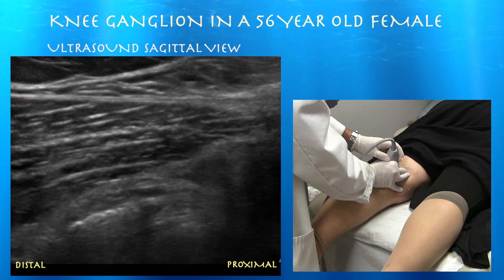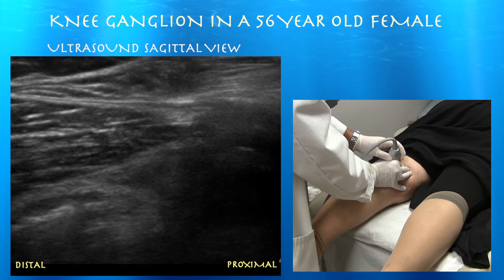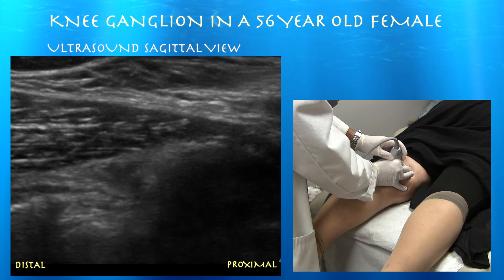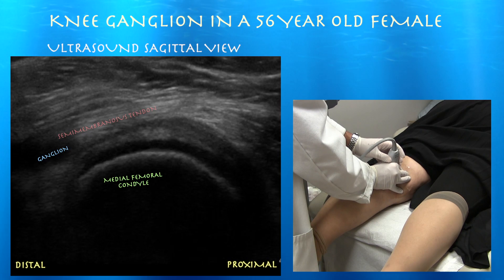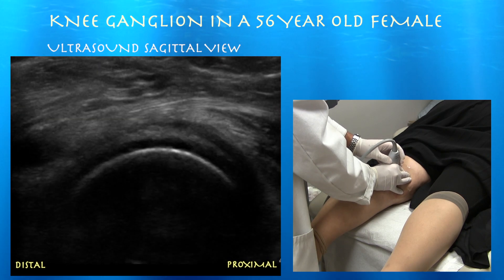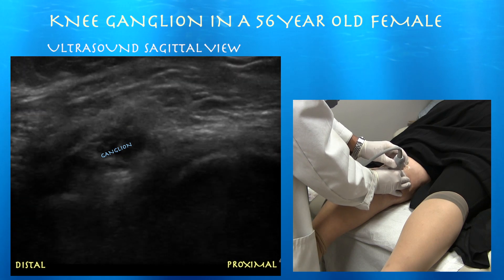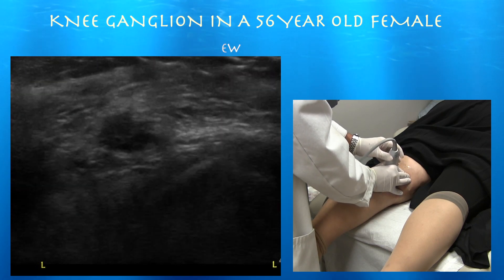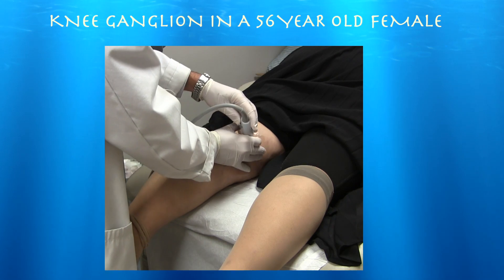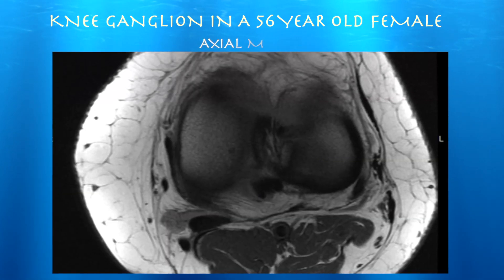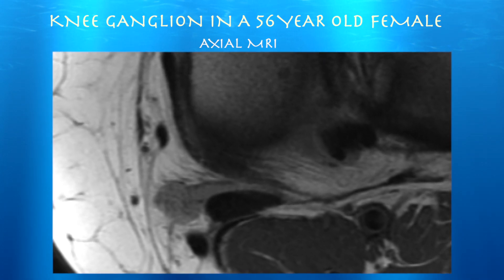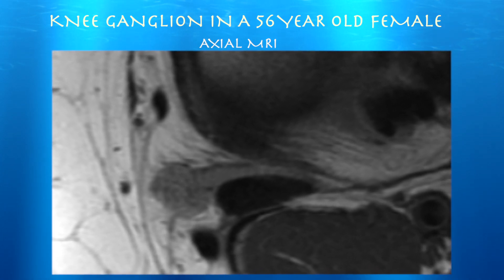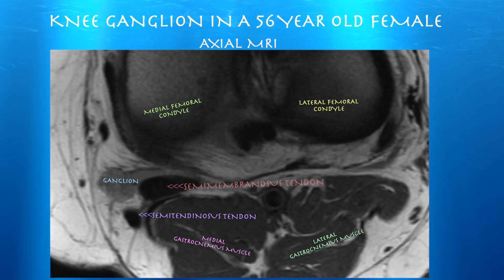We've got the medial gastrocnemius muscle, and the right side of the screen is proximal. As we go medial, you can see the semimembranosus tendon — here again is that thick semimembranosus tendon just over the medial femoral condyle. And here we can see that cyst in the subcutaneous fat. On axial MRI, you can appreciate that ganglion just wrapping around the semimembranosus tendon and going medially. You can also appreciate that the semimembranosus tendon is a pretty thick, wide tendon.